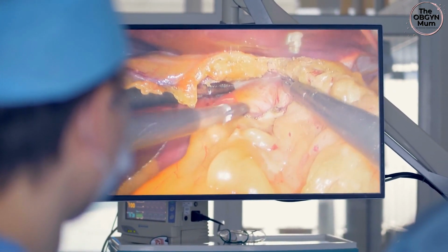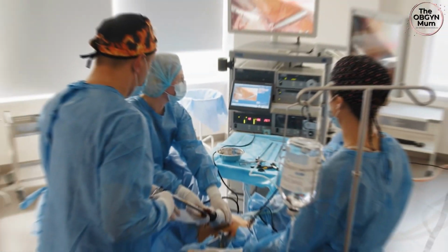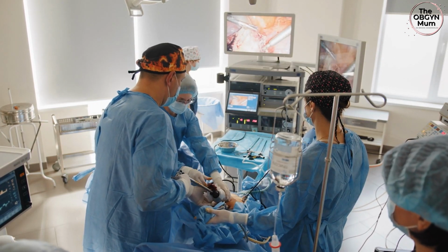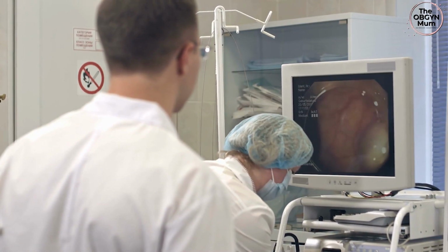Well, a laparoscopy basically means a surgery, an operation that is done to see inside the abdomen, in the tummy, without making any large skin incisions. It's known as keyhole surgery. A diagnostic laparoscopy means that you're simply putting in a camera inside the tummy, so a small tube that's known as a laparoscope is inserted usually through the belly button, but sometimes we insert it in another part of the tummy first. It has a light on it and a camera, and that gives images of the inside of the abdomen. A diagnostic laparoscopy is used to identify a cause for your symptoms, so if you don't know what's going on, and also to help to plan treatment.